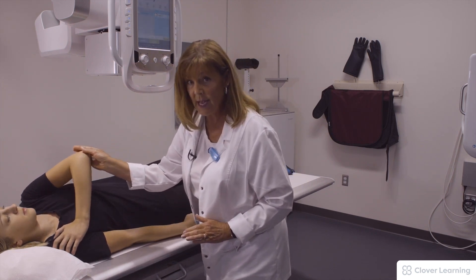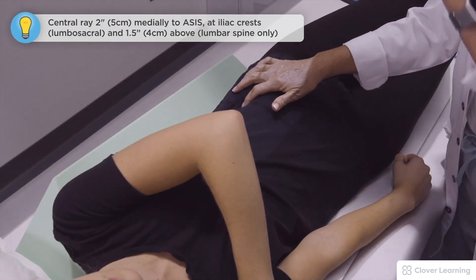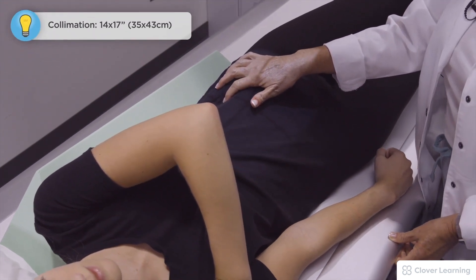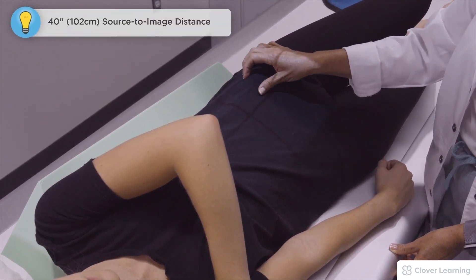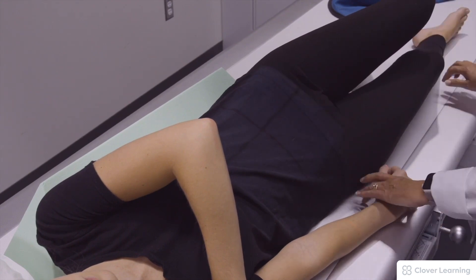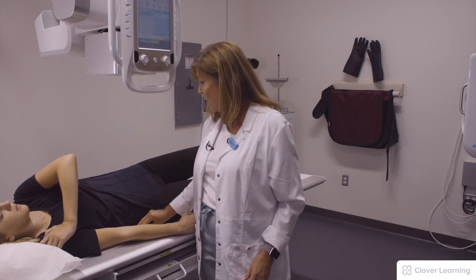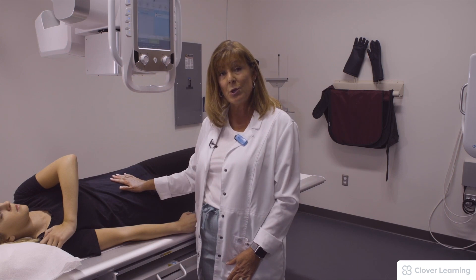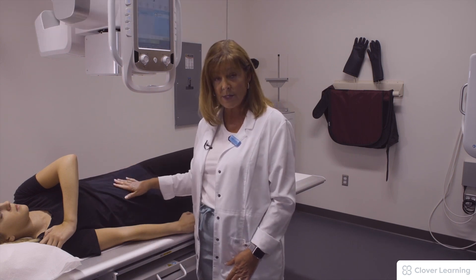I'm going to make sure her elbow is out of the field of view, and I'm going to use her crest, centering an inch and a half above or at the crest, and then two inches medially to the ASIS. This is rolled to the right so I will use the right marker indicating the RPO. You will see the Scotty dogs on this view, and you definitely want your patient to exhale — that raises the diaphragm so we can see the lumbar spine much better.